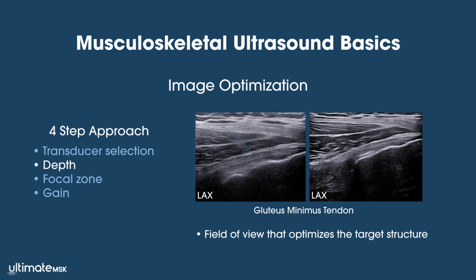However, in my experience, a larger field of view allows for a visualization of the full muscle tendon unit, which helps to optimize the transducer's orientation in the long axis position. In addition, early pathology often begins at the myotendinous junction near the distal edge of the anterior facet, which is easier to detect with a greater field of view.